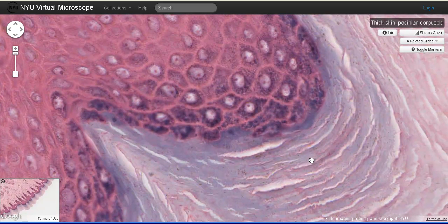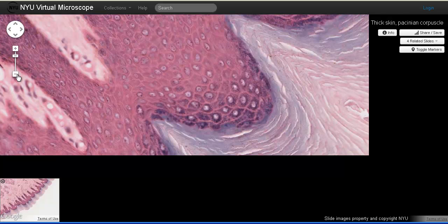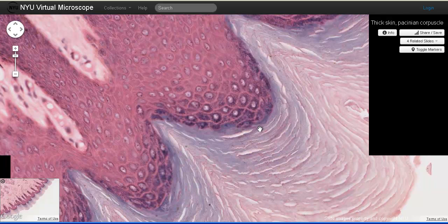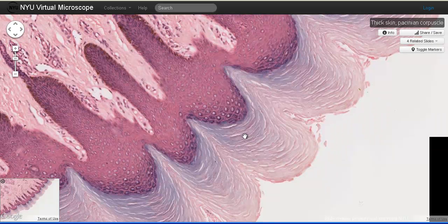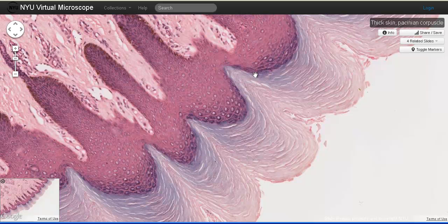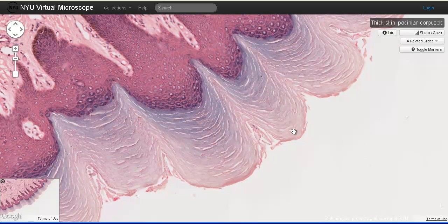The stratum lucidum is a translucent layer visible in thick skin — this zone right here. And then the stratum corneum: notice that the surface cells or squames are being sloughed away. The attachments — the adhering junctions, desmosomes — are degenerating in this region, so the surface cells begin to slough away. Both the stratum lucidum and the stratum corneum contain cells that are dead.